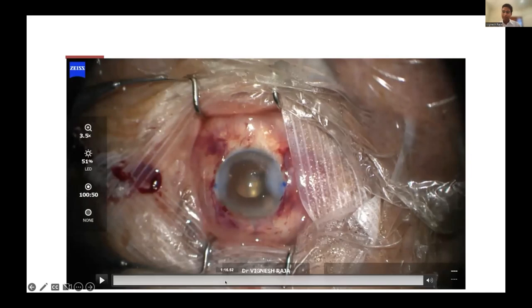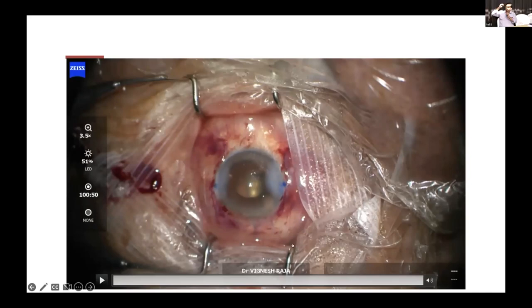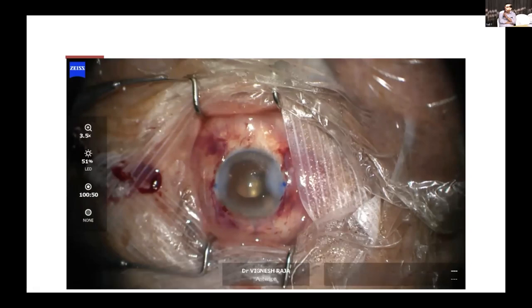So any questions at all from this case? No, this looks so simple and easy with you. I can't believe that it is your second case or third case. Looks so clean. This basically 3 millimeters means you're close to pars plana. So I am.